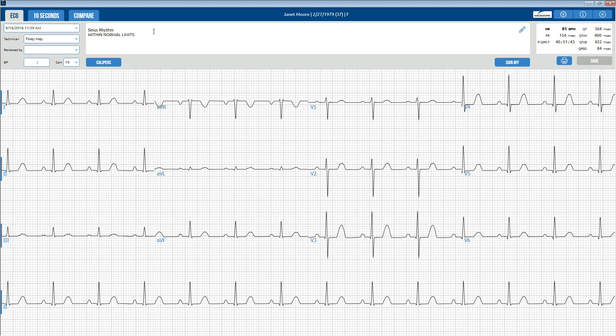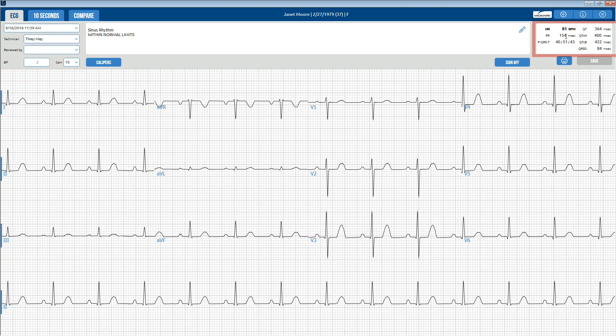The date and time of the selected report, name of the technician conducting the test, and the patient's blood pressure, if entered, will appear on the top left side of the screen. The general measurements are displayed on the upper right portion of the report review screen.